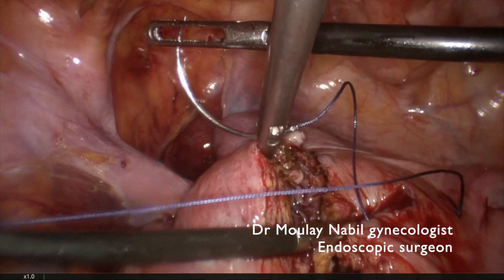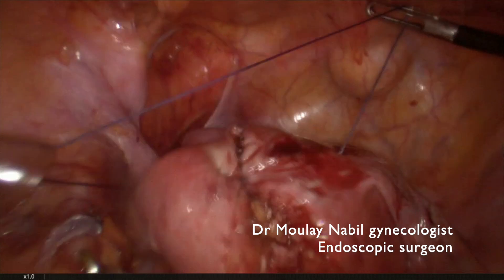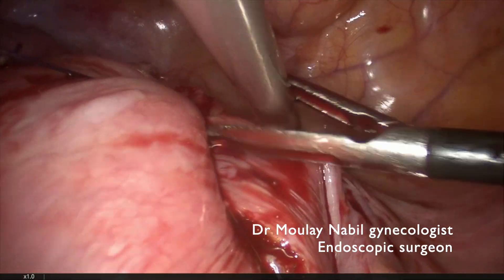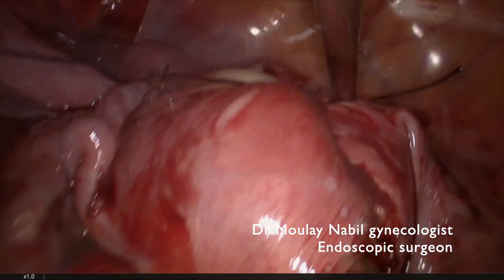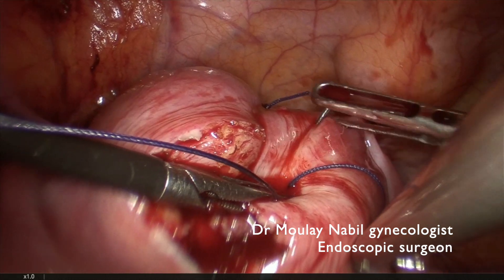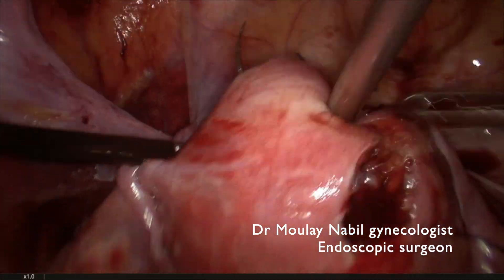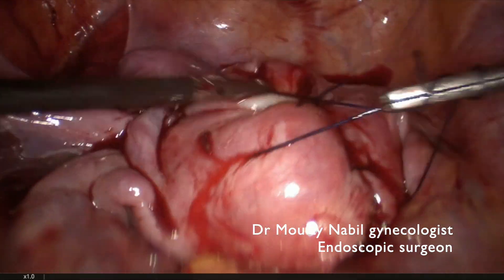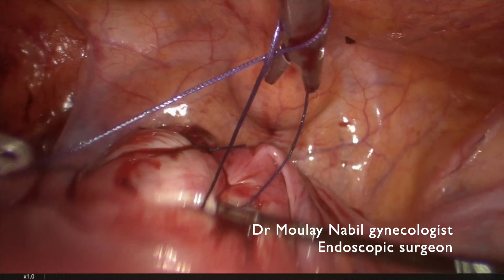As I said before, don't lose time on bipolar hemostasis — use the stitch. The same technique: invagination of the healthy myometrium inside the myoma bed. Take care at this level not to include in your stitch the proximal part of the tube, which is sometimes closer than we think. With invagination, the anatomical result begins to look better and better.